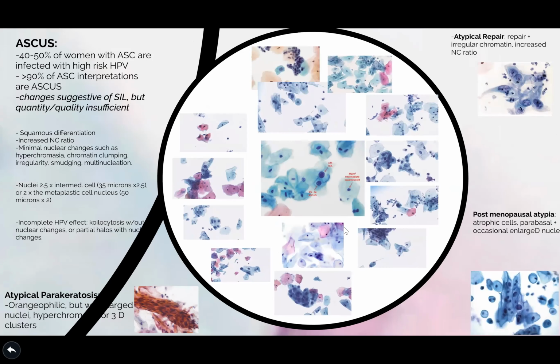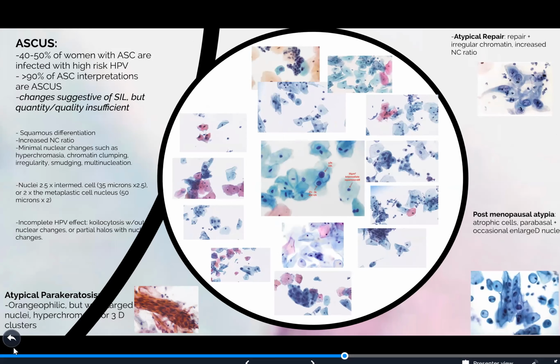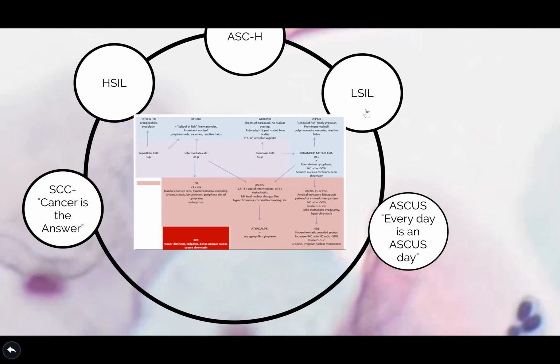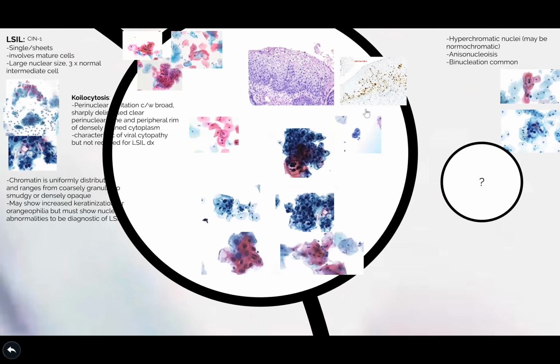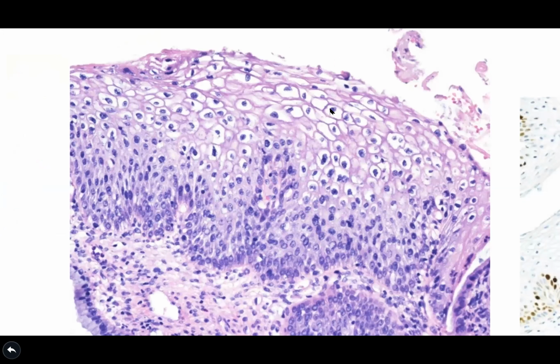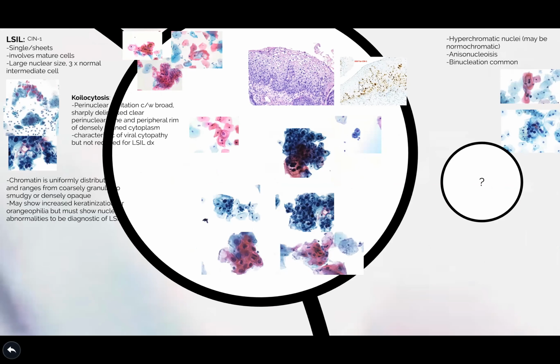All right. So let's talk about, looks like I, what's the word? I jumped there for a moment. Next, move on to LSIL. So LSIL, if you remember how it looks in H&Es, you have these koilocytic changes, right? So what you're seeing is basically this H&E, and you're seeing it on the side as just the cells.